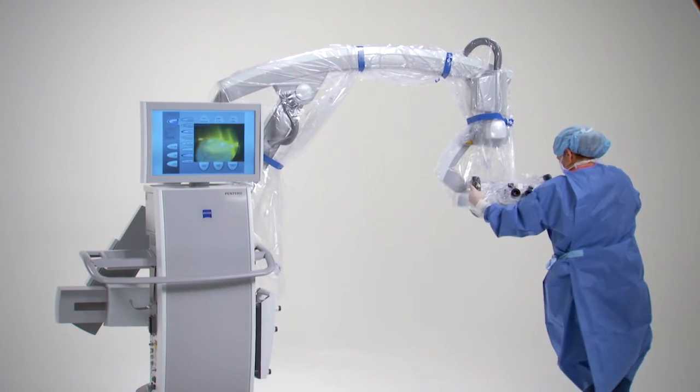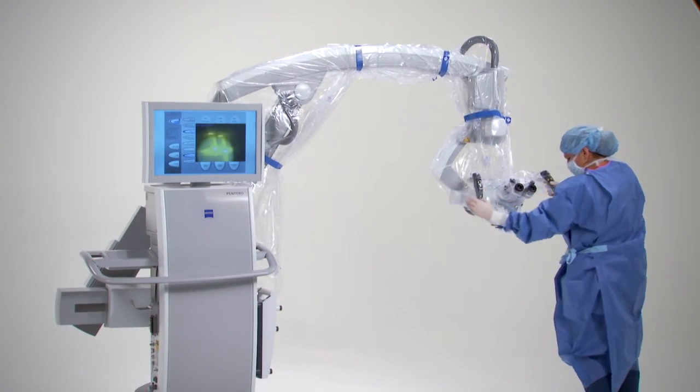Once the drape has been secured, check to ensure ease of movement of all controls.